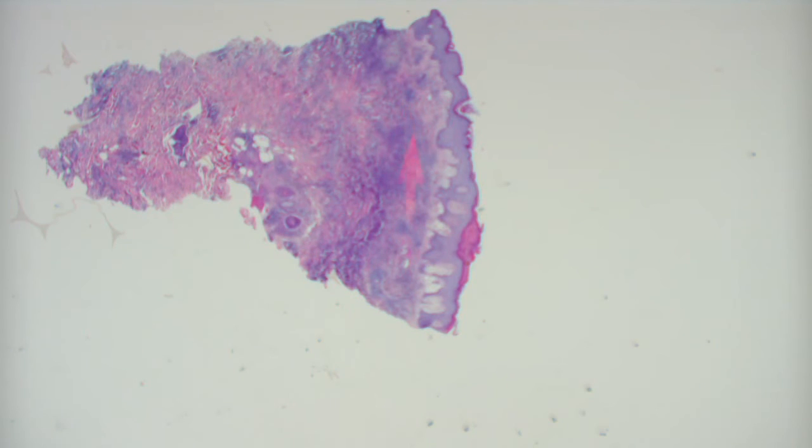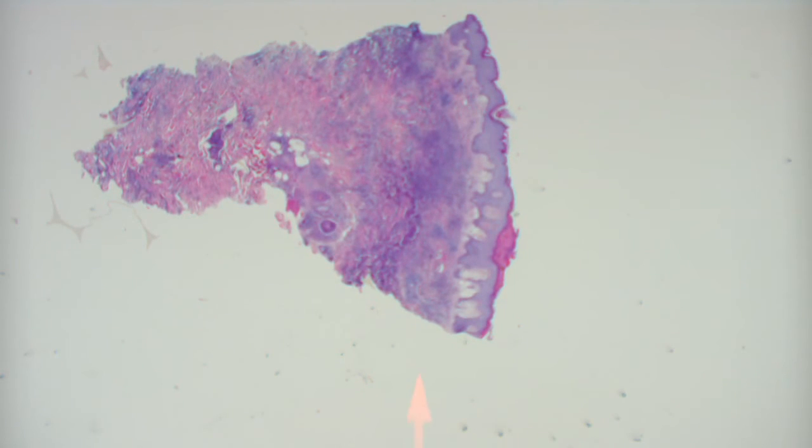Yeah, and you can see that it's also got just very tiny clear structures around it. That's characteristic of neutrophils, kind of a salt and pepper morphology as opposed to jet black at low power. So you'd be able to recognize neutrophils pretty quickly with higher magnification. But when you see this pattern of a dense diffuse infiltrate with neutrophils and papillary dermal edema, you have to think of Sweet's. You must think of Sweet's.